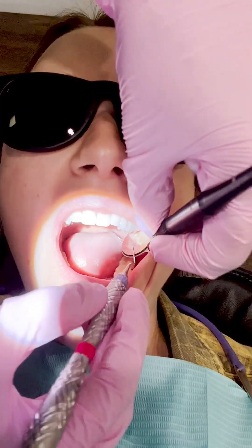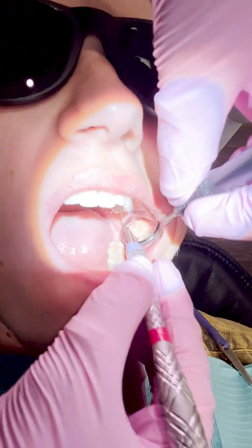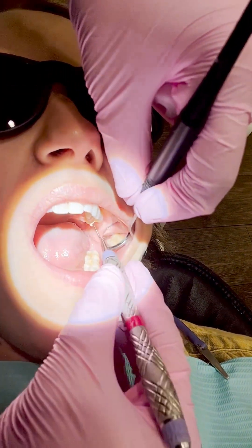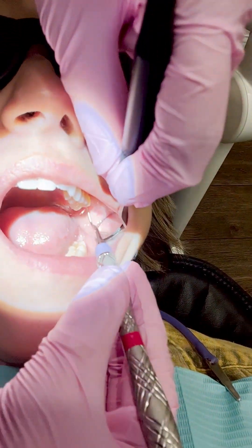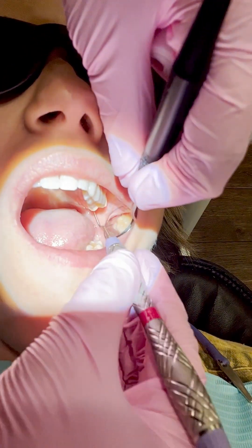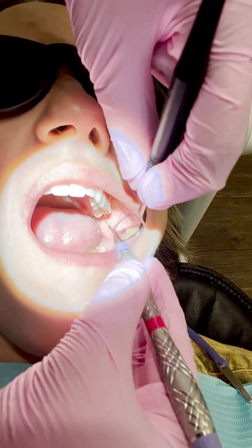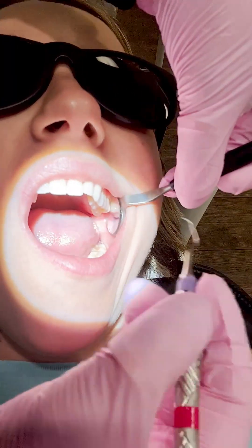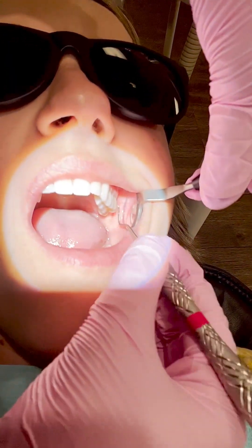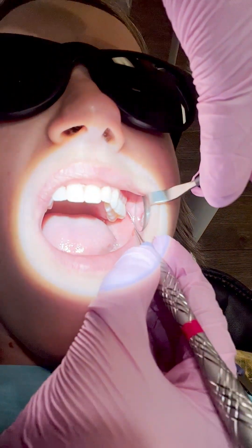I put different colored bands on the instruments for the video. Now I'm going back in with my extended sickle, getting the distal of number 15. I retract, and you can see I'm fulcruming on the external of her mouth, getting into that distal. This area is missed all the time, but see how I can see it easily just by retracting. I use a double-sided mirror by Hugh Freedy — it is awesome. You can retract, and for probing on the buccal of the upper left, it's amazing.